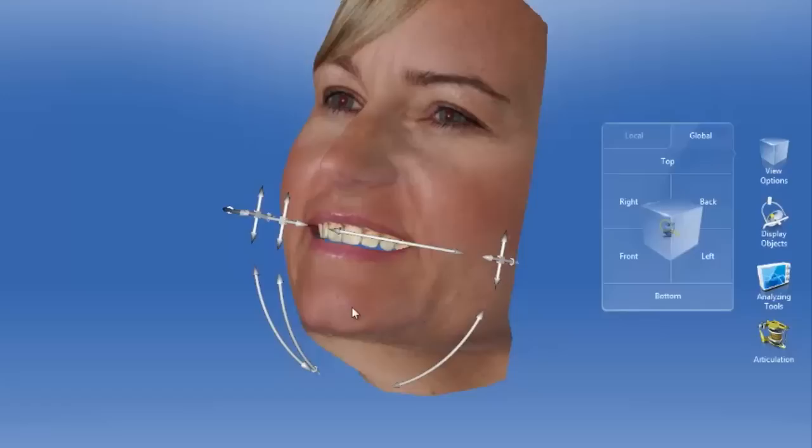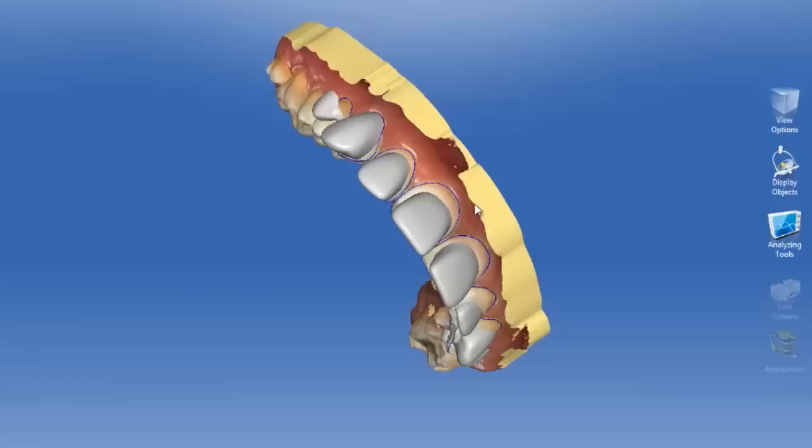We let CEREC figure out the proposals or the shapes of the teeth. With a little modification, we can have eight veneers ready to go.